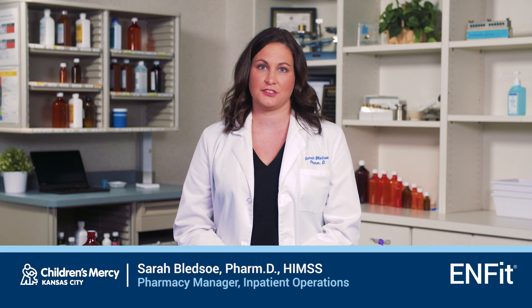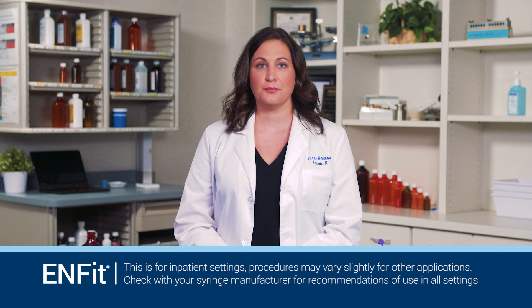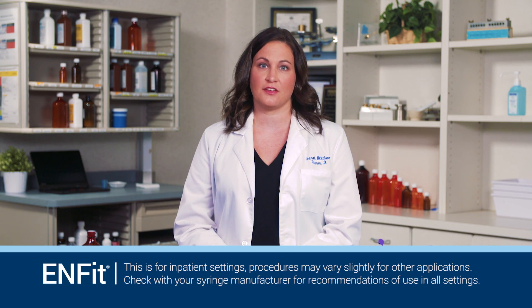My name is Sarah Bledsoe and I'm a pharmacist. Today I'm going to introduce the procedure for preparing and administering medications using ENFit. This procedure will be applicable to patients of all age groups in inpatient settings. The ENFit system is the new industry standard for enteral connectors. It promotes patient safety by reducing the risk of misconnection between unrelated systems by implementing a unique mechanical design.